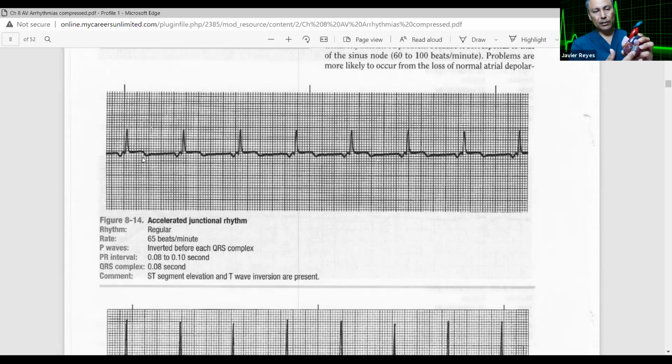An infarct means the tissue is dead. So when the signal, the impulses, are coming down to stimulate it, they run into this dead zone, and you're like, "Oop!" The signal gets rejected. It comes back up, so you see an inversion, right? An inversion of the T wave. Does that make sense?